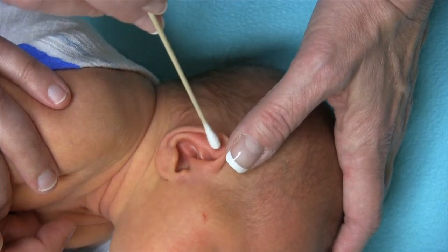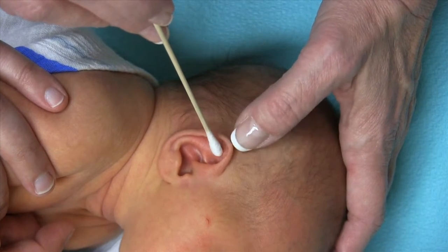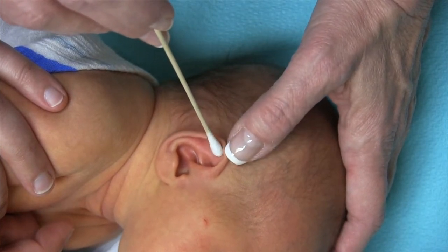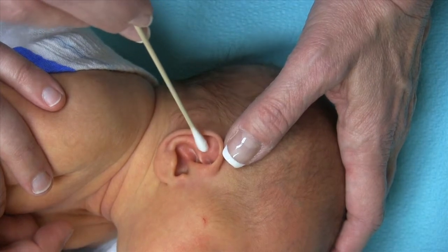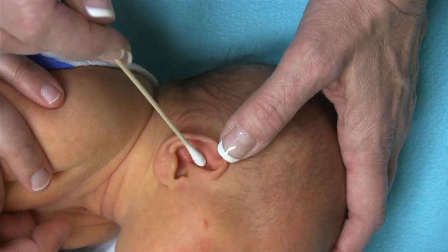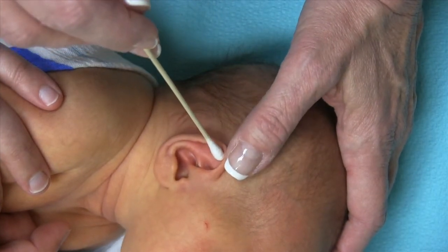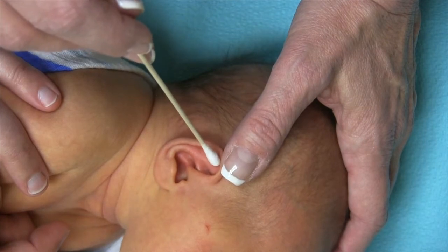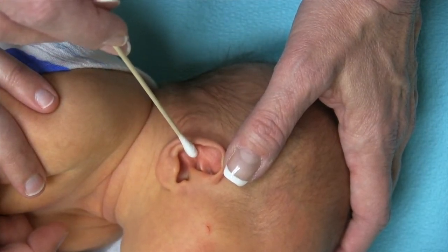In dealing with this transverse crus, because this is a little bit higher, this is going to be a challenge as far as placement of your retractor. You've got the posterior former behind the superior crus here that's helping form that, but you're stamping this out. When you are placing your retractor, you want to make sure that you're not placing it directly over that posterior former.